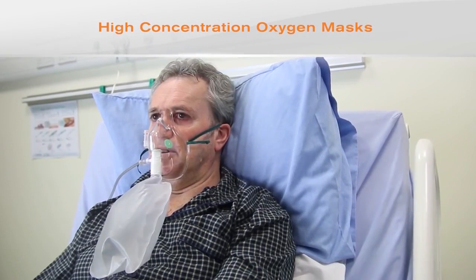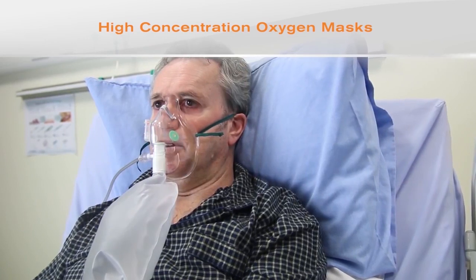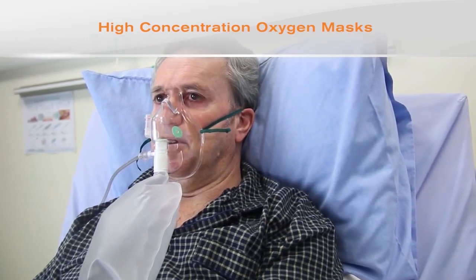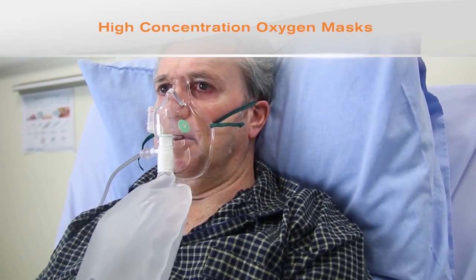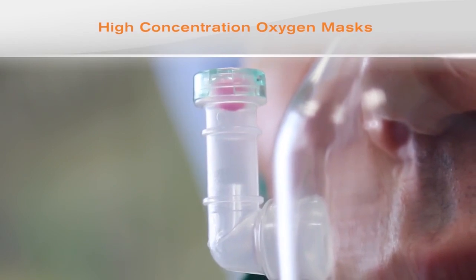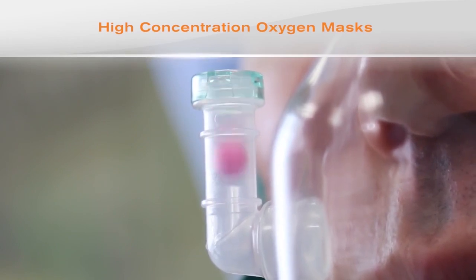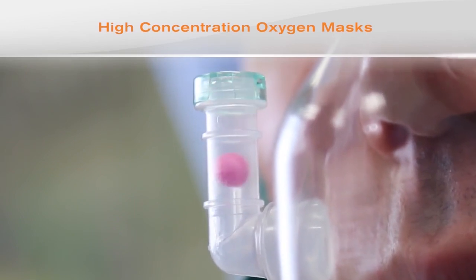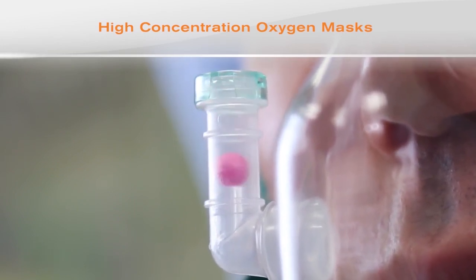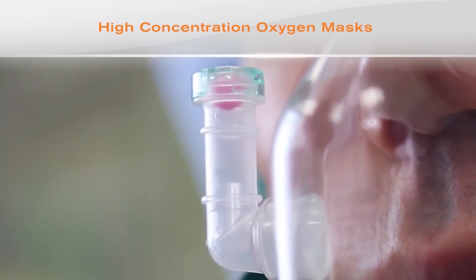An additional feature found in some high concentration oxygen masks is the RespiCheck breathing indicator. Respiratory rate should be recorded in anyone requiring oxygen therapy, and yet it is often inaccurately estimated and poorly recorded. The RespiCheck features a ball contained in a clear plastic tube which acts as a visual indicator of respiratory rate. The flow of oxygen into the mask pushes the ball to the top of the tube. The negative pressure generated by the patient's inspiratory effort pulls the ball to the bottom of the tube, giving an instant visual notification of each breath taken.